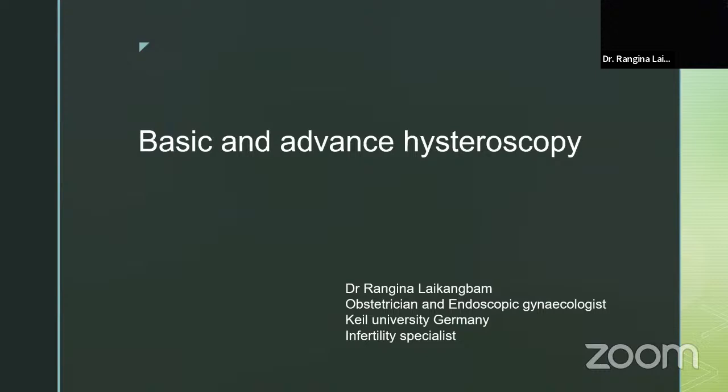But in hysteroscopic guidance, we put the telescope inside the uterine cavity, and we can see if there is any abnormal growth, and then we can take that specific tissue. In DNC, we cannot take this specific tissue.